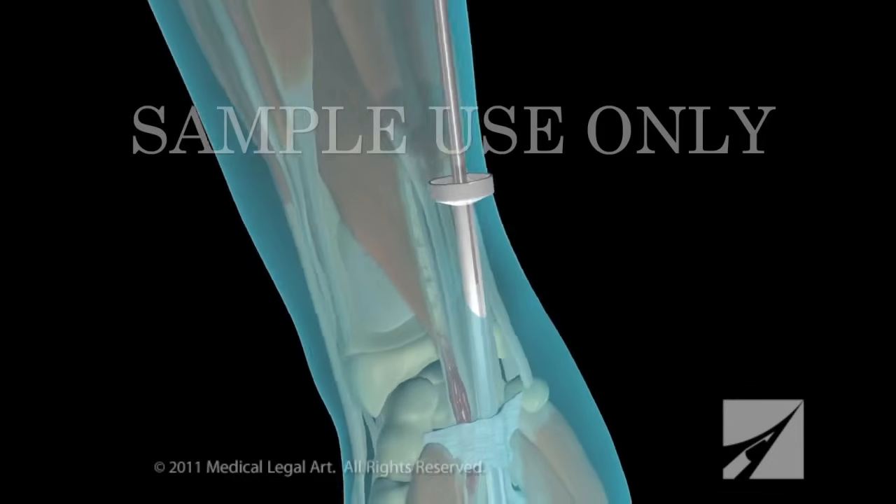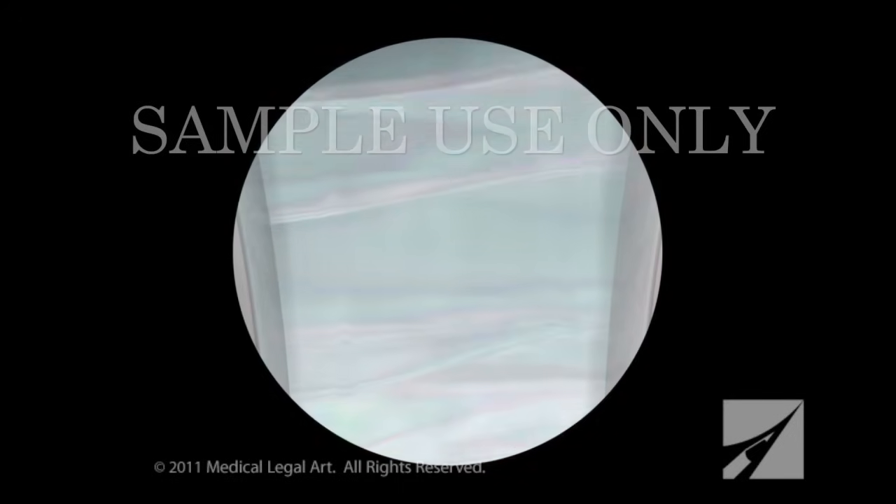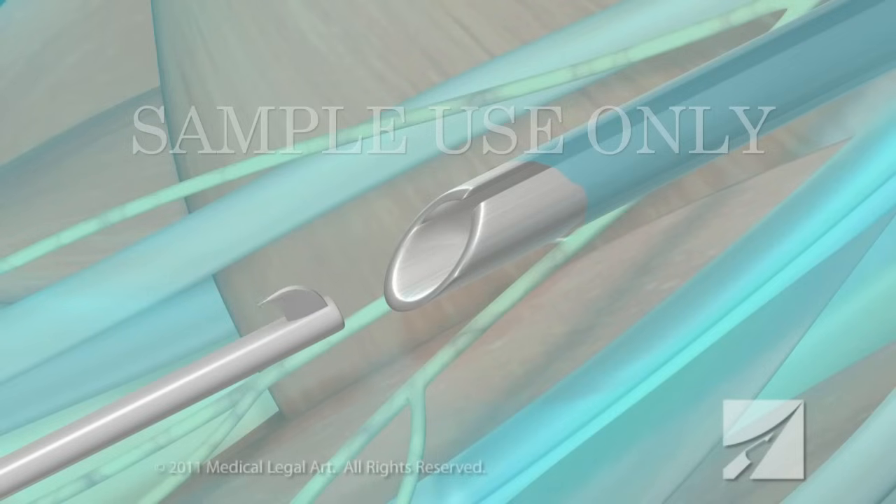Your surgeon will then insert a fiber optic device into the wrist port. Images from its camera are magnified and projected onto a video monitor in the operating room. Using instruments passed through the other port, your surgeon will cut the transverse carpal ligament.